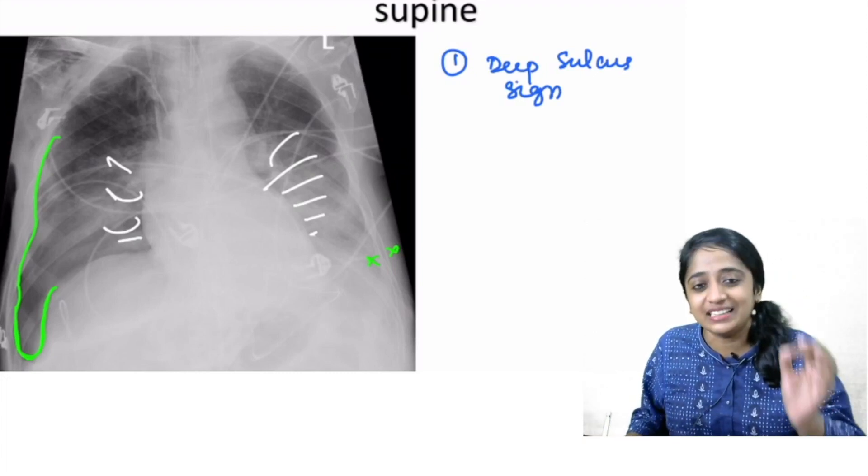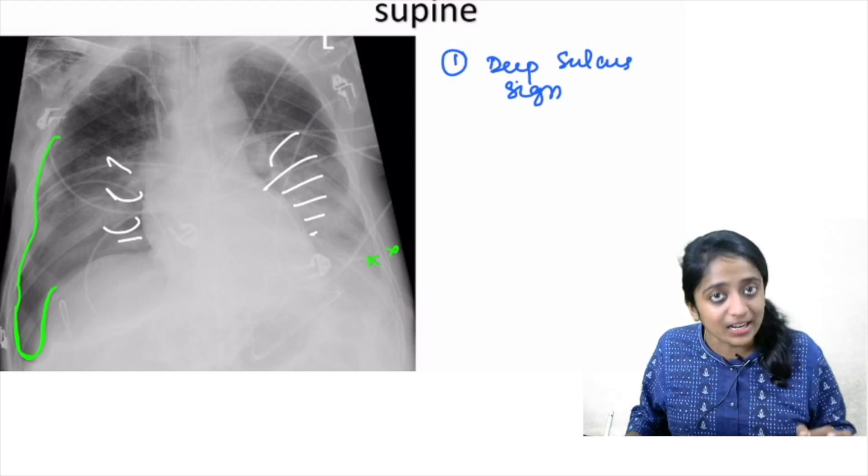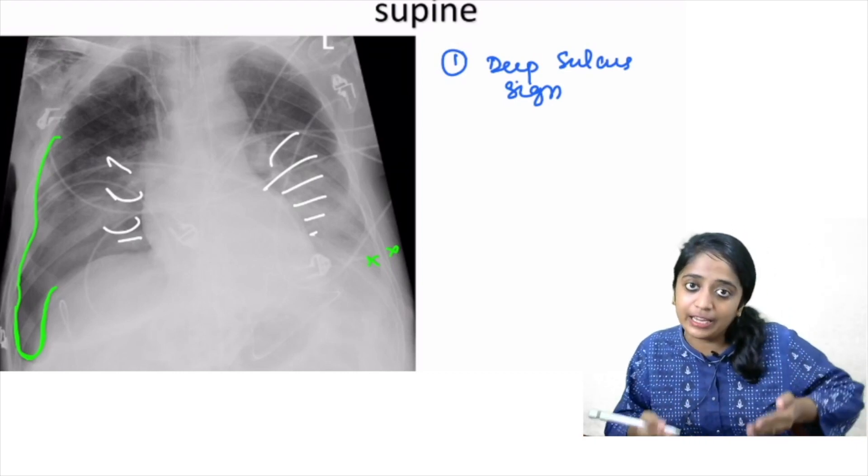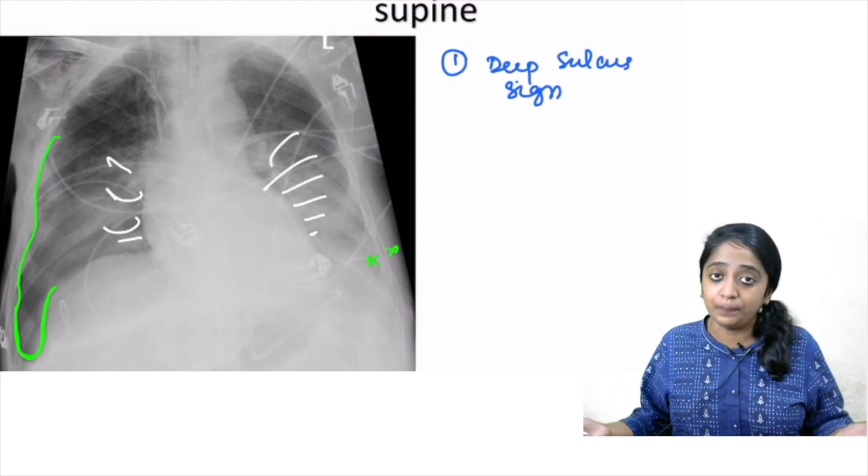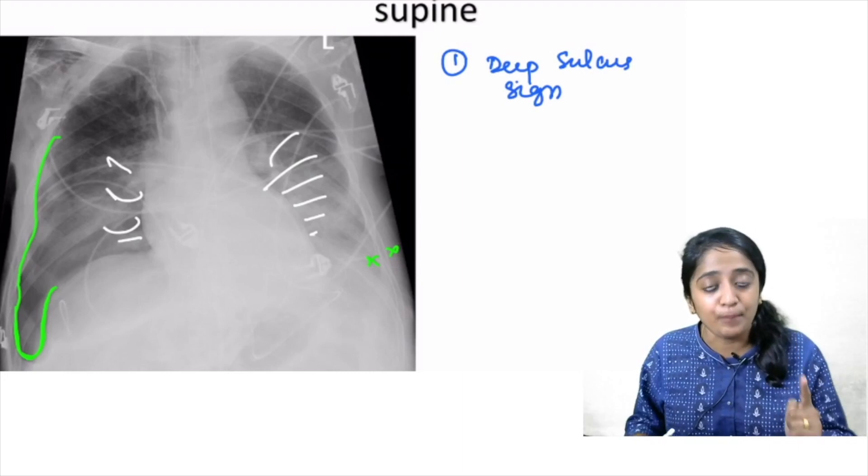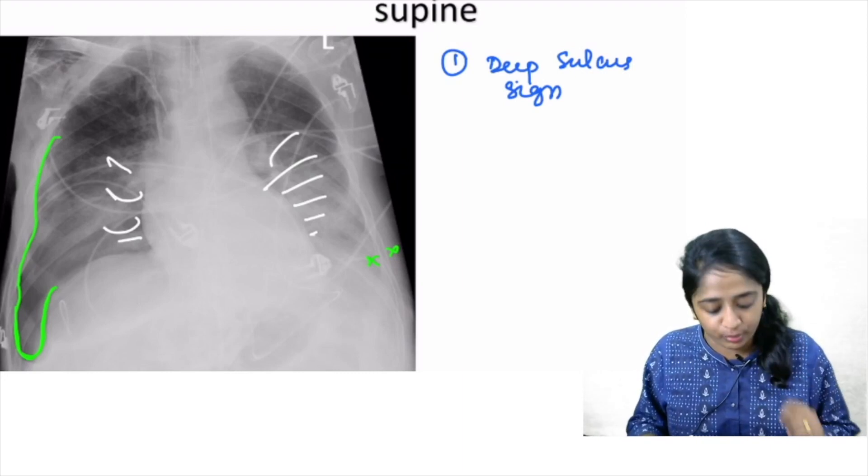So what does it represent? It represents the air collected within the pleural cavity, where specifically between the costophrenic angle, anterior and inferiorly. When the patient is lying supine, that is the non-dependent area. So deep sulcus sign is an important sign of pneumothorax on supine radiograph.